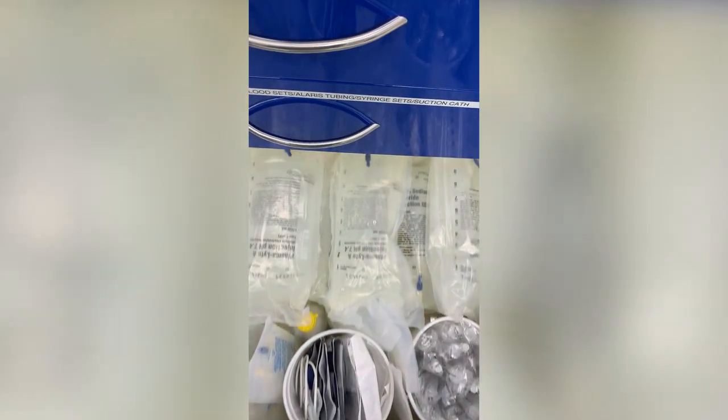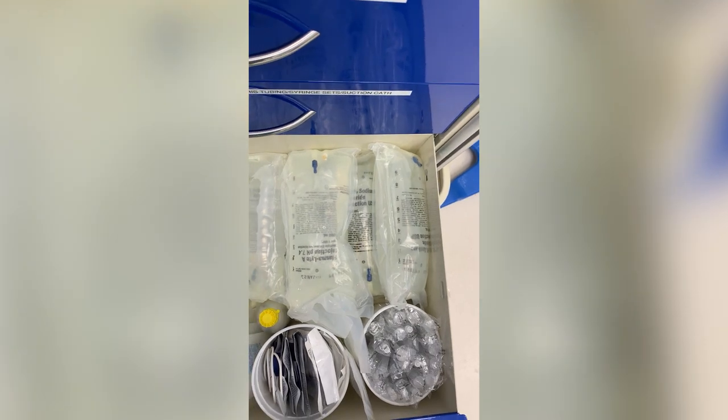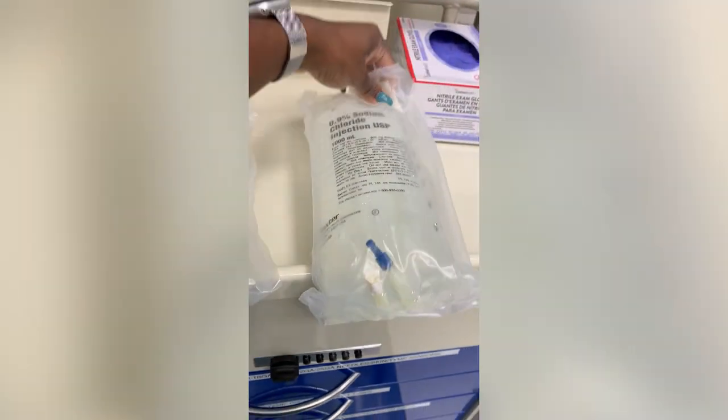IV with a bag of fluid. Ta-da! Lots of IV fluid. Plasma-Lyte is what we like to use in my hospital, but most other places will actually use normal saline, very standardly. And that is the IV fluid of choice.